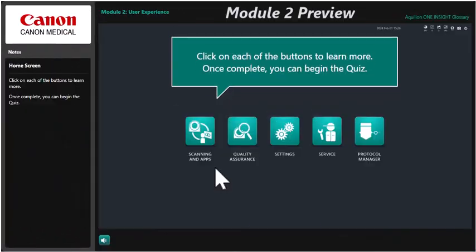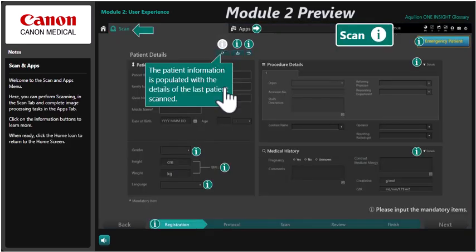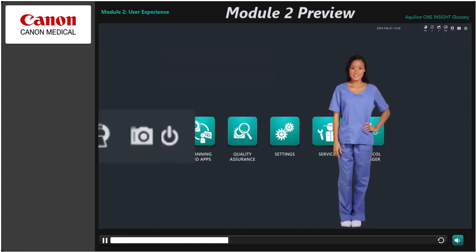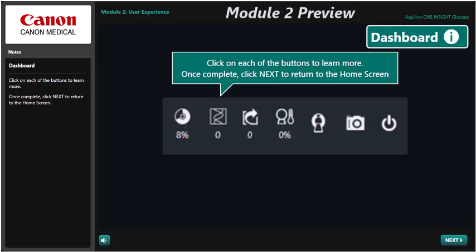Module 2 for both of these courses focuses on introducing Instincts, Canon Medical's new user experience. The module is designed to interact the same way as the scanner itself and will give you an overview of all main buttons and menus, helping you to quickly familiarize yourself with using the software.